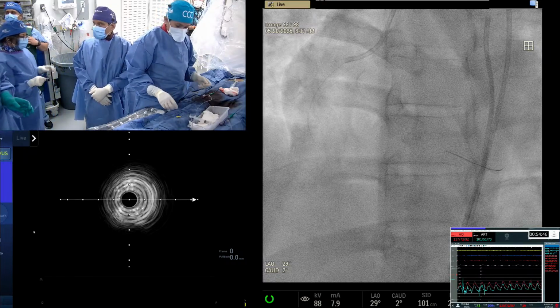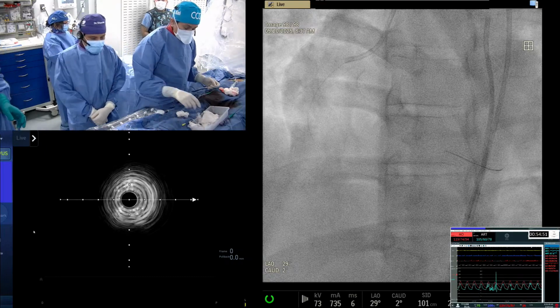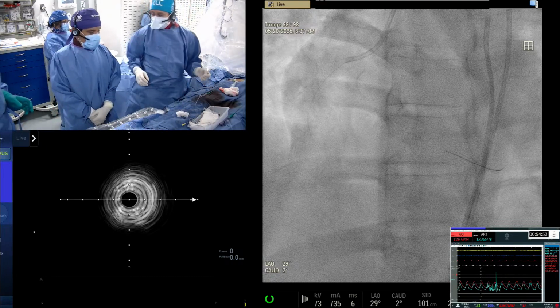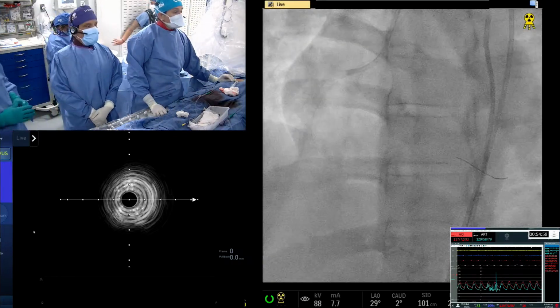It's the Nanto technique, right? Japanese doctor, Nanto technique. Yeah, the chance of unsuccessfulness is 20 to 30%. You want to do it? Do it. Okay. Now let's get it now.